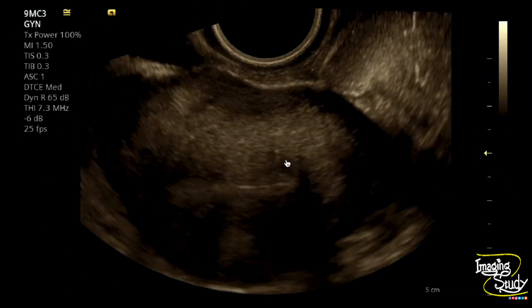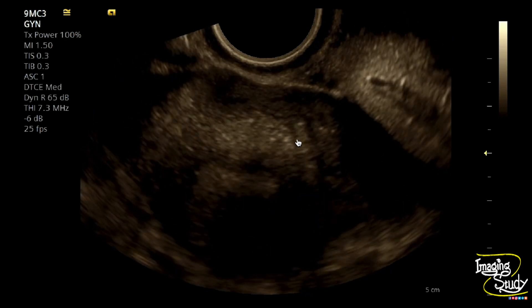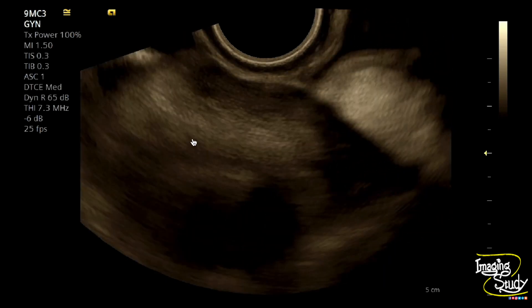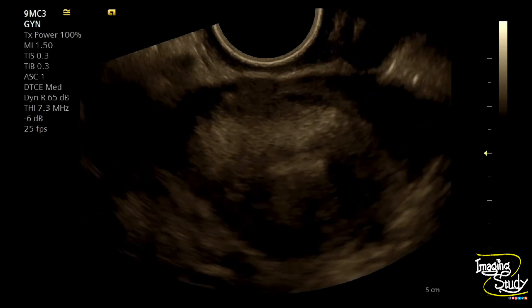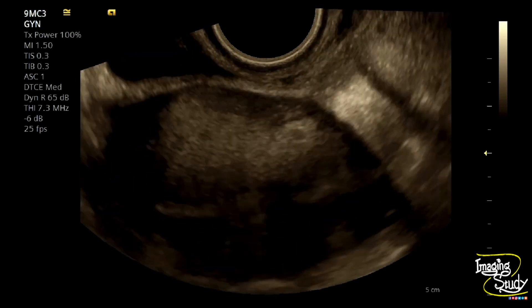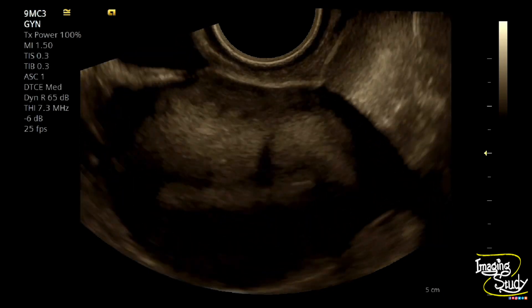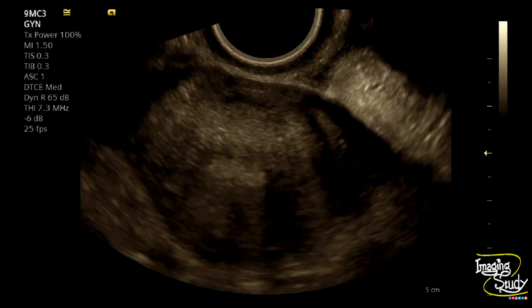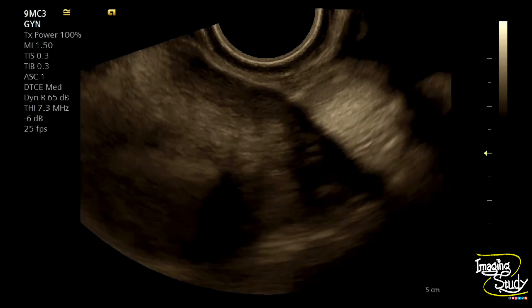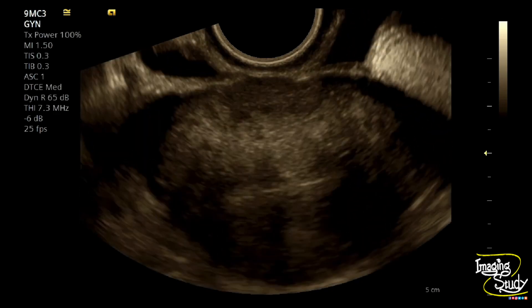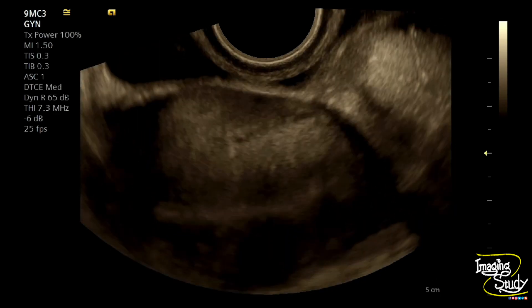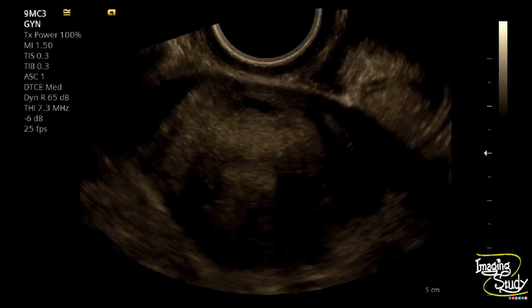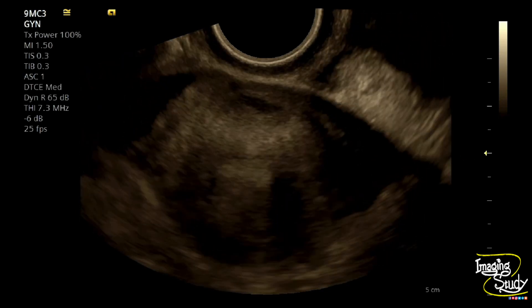Here is the transverse section and you can still see this heterogeneous antero-myometrium. It is very important to understand your machine resolution. If you switch between multiple machines, adenomyosis or this inhomogeneous appearance may confuse you, but when working on a single machine for a long time, you will not miss this inhomogeneous texture.